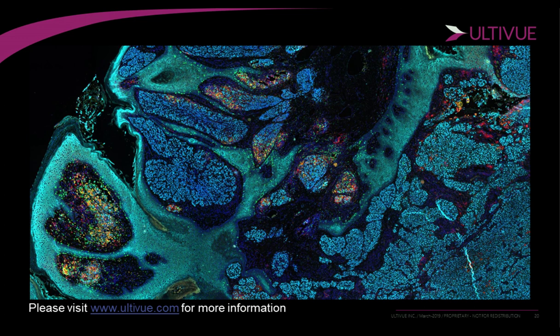as time progresses. I know I've also had slides that I've basically carried around with myself for 6 months in my bag, and they still scan incredibly well. And that's also to keep in mind too. It also is a little bit dependent on what type of scanner you use to visualize these. Our dyes are very stable.